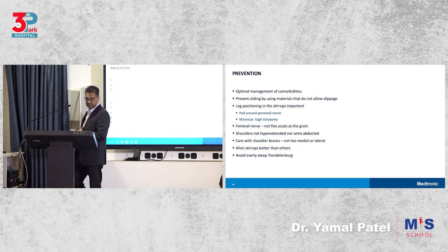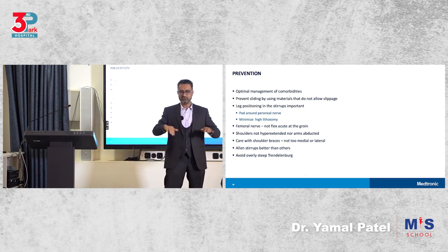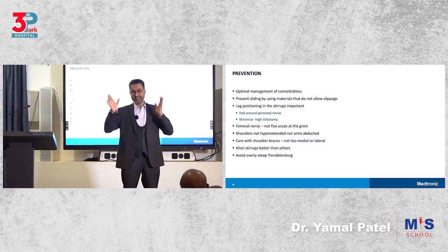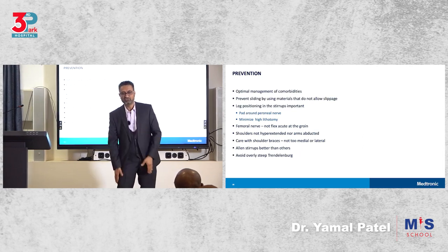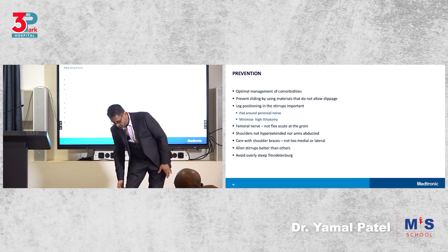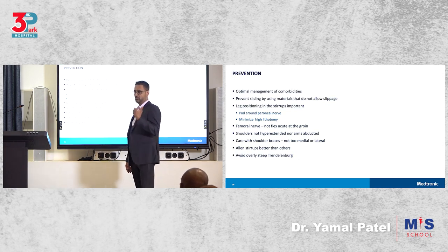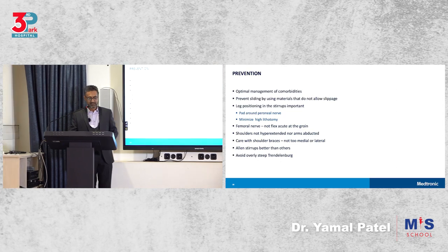So that is important. Leg positioning in stirrups, have a padding around the peroneal nerve, but with the new Allen stirrups, etc., you may not need to have padding because they're already padded. But if you have those old types, candy cane or those other knee stirrups, make sure you support this area. If you press this for too long, when they wake up, they'll have a foot drop. Okay? And you'll not understand why they've had a foot drop when I've done nothing in the leg, but it's your positioning.